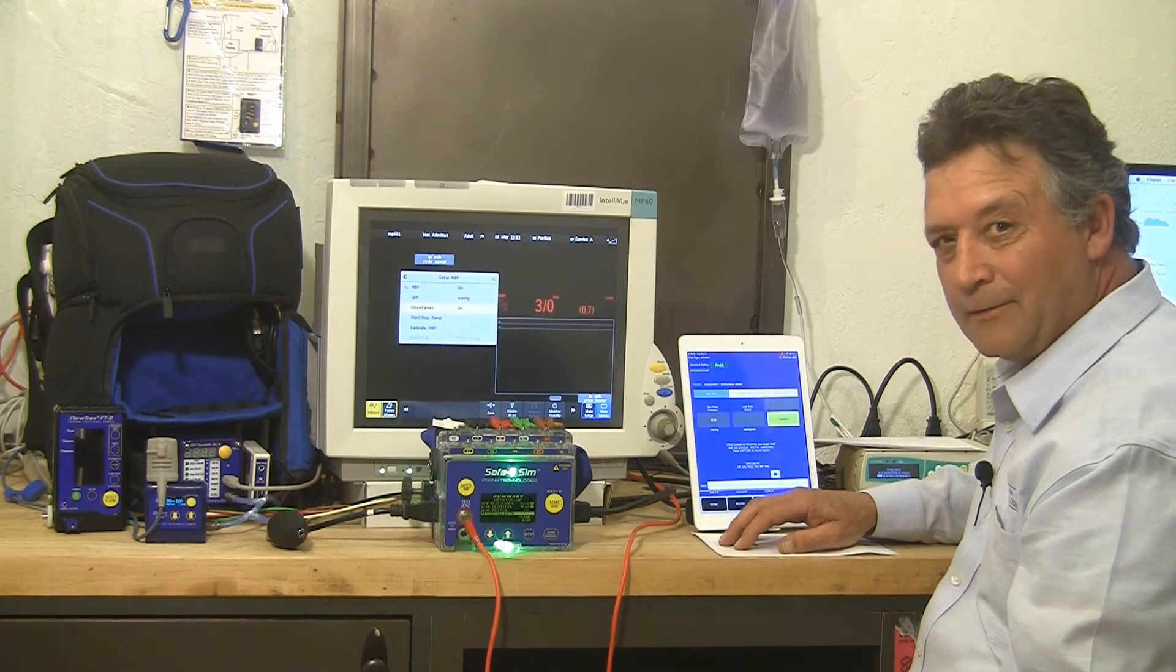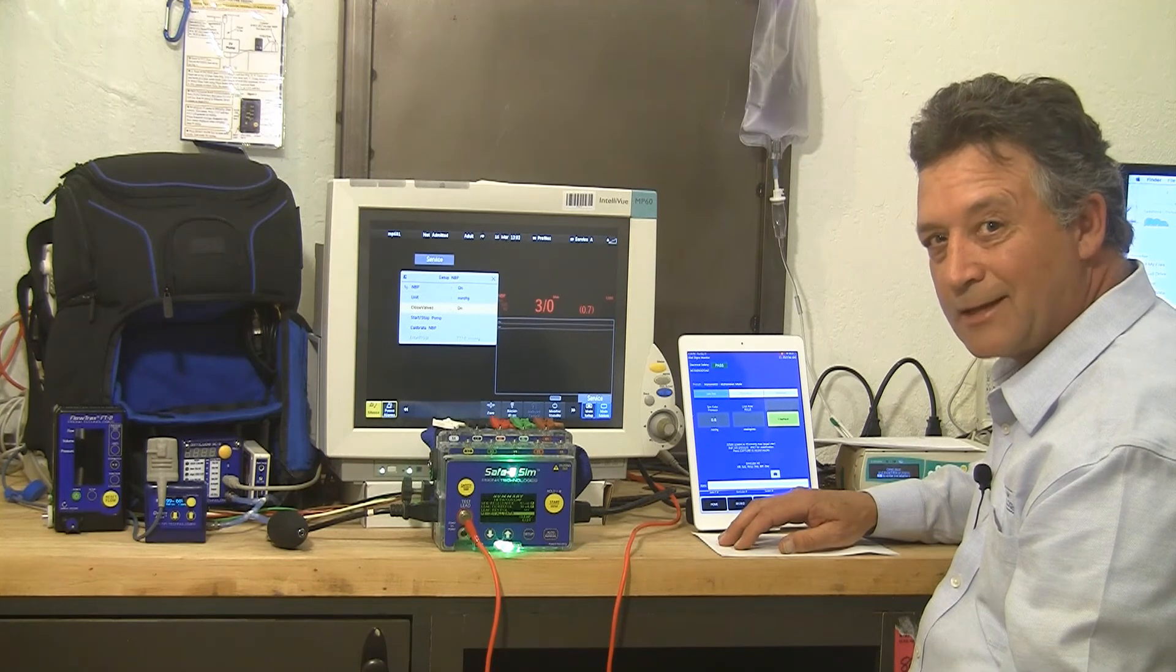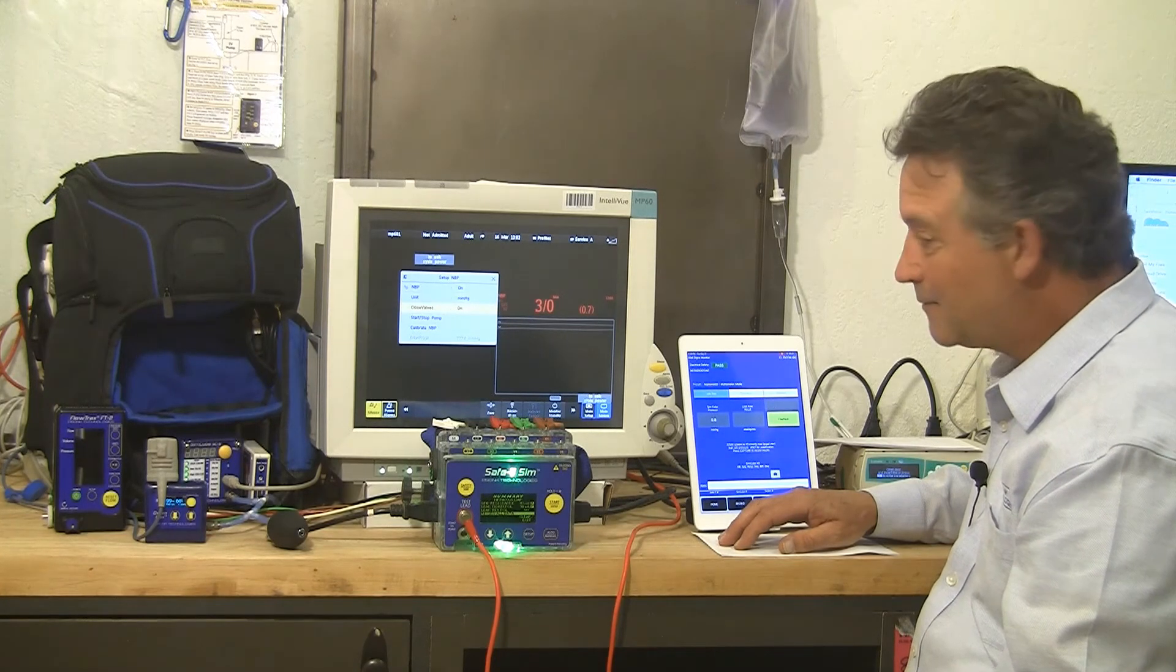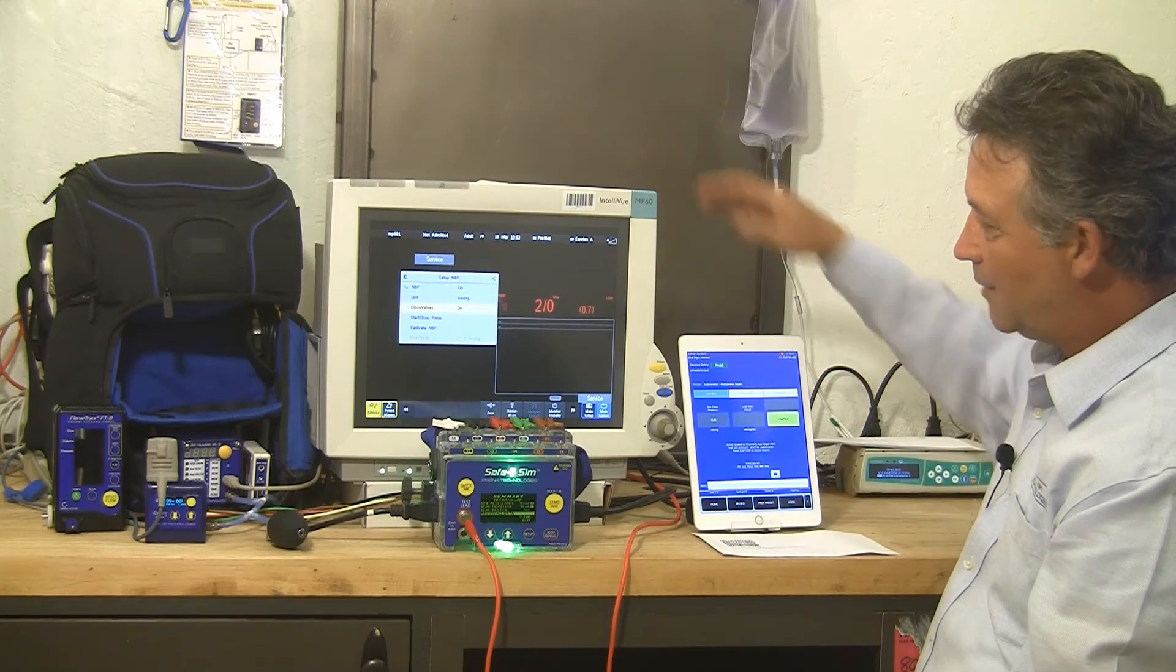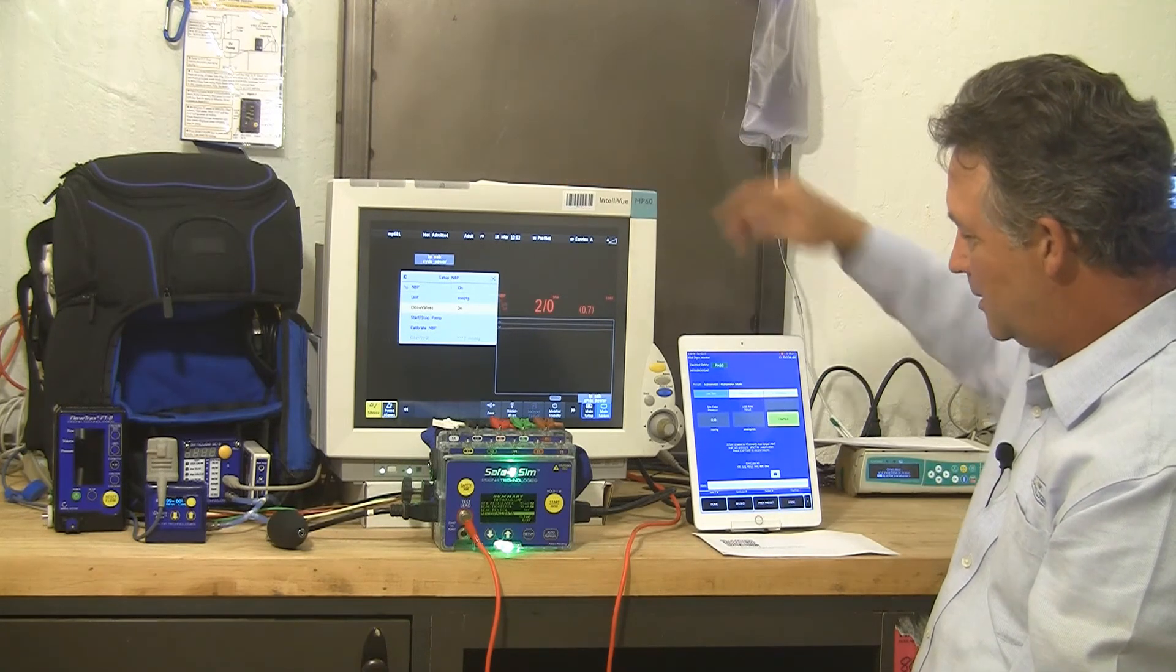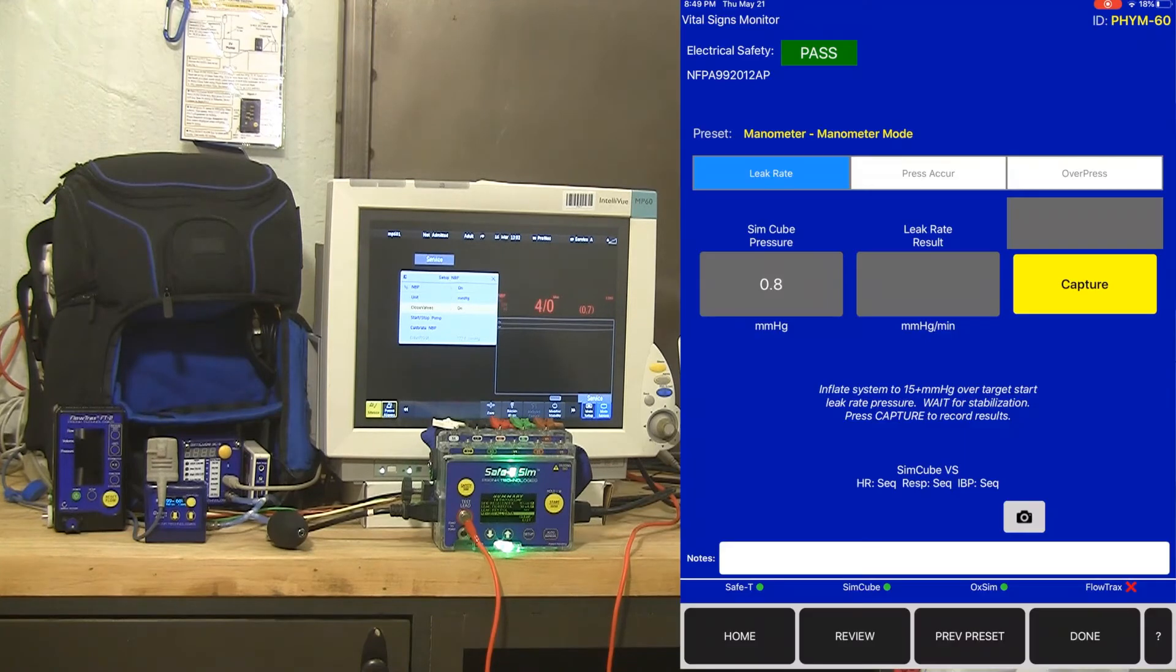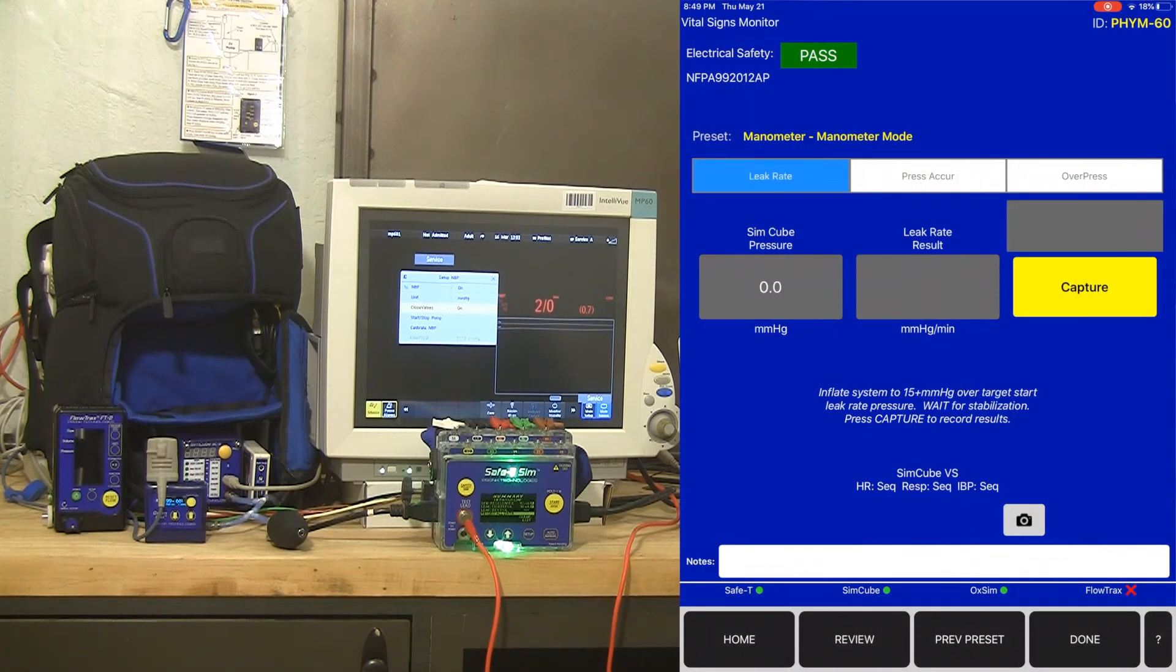Okay, so now we're going to go ahead and do manometer testing on the NIBP circuit on this vital signs monitor using our app. So I've already got the monitor into service mode and I've closed the valves. From our app, we've got three different selections in manometer mode: leak rate, pressure accuracy, and over pressure. We're going to start with a leak rate.